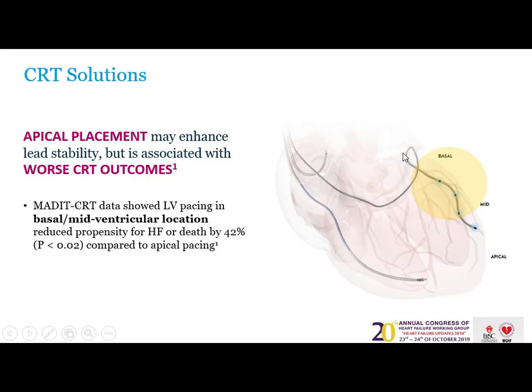As we were discussing this morning, remember that Mazen pulled the bipolar lead away from the apex, and Rania was asking him, "Are you sure the lead will be stable?" And he answered her, "Yes, I'm sure, because my sheath is inside the vein. After the neck of the vein, I'm not inside the CS, because my guiding catheter is deeply inside the vein, so my lead is stable."